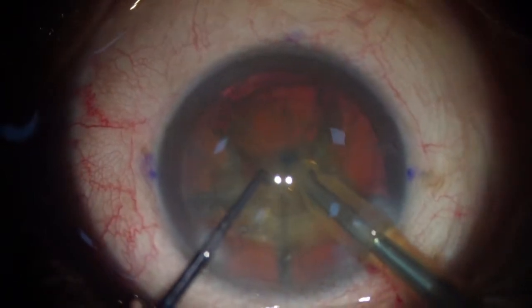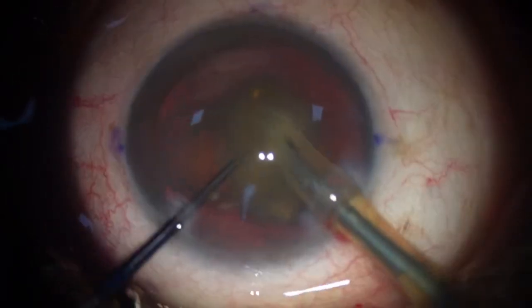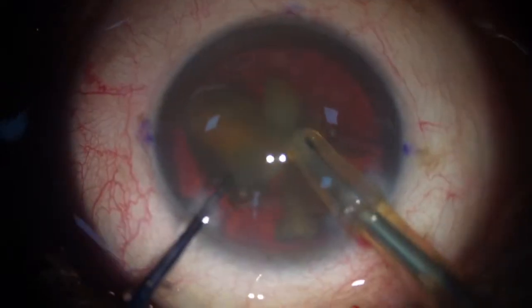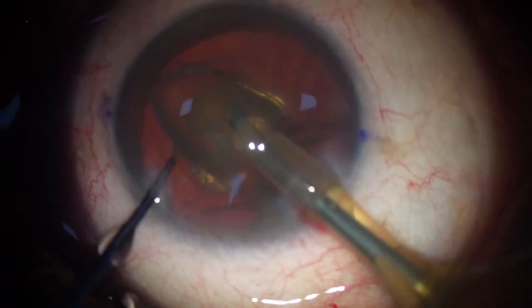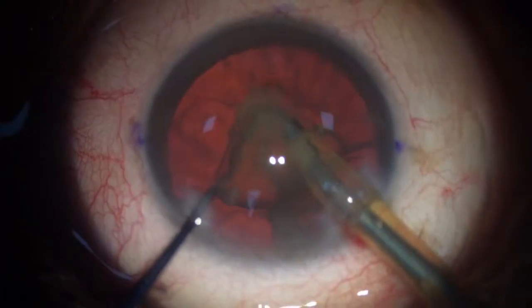So now we are going to go to the quadrant. So the chamber stability remains extremely good, and you can get away even with the very hard cataracts with bottle heights of just 40, as I'm showing you right now. And the chamber stability never suffers.